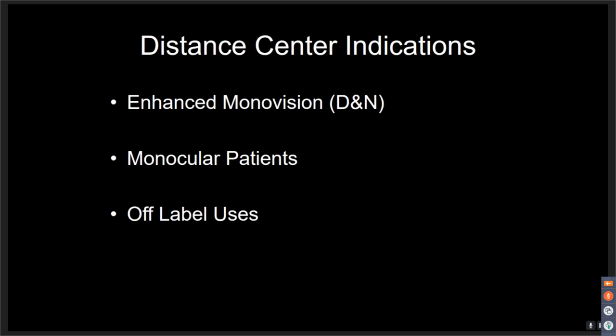Now, when the patient walks outside and they've already got, let's say, a 2.2 or 2.4 millimeter pupil, and that pupil closes down, well, they can see distance well, at least with the left eye, with that little bitty pupil. And then at night, when they're driving and the pupil may open up to, you know, 3.0 or 3.2 or 4, that pupil opens up, and then the dominant eye actually goes out into more of the periphery. And as it opens up, it has more of the distance area in front of it. And that's the eye that they're going to use. So no matter what type of lighting situation in that type of scenario and that type of design, a lens will work.